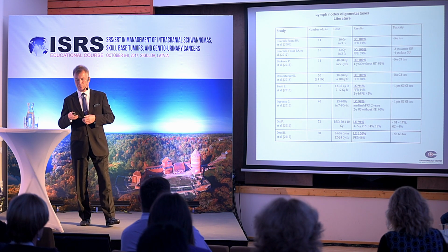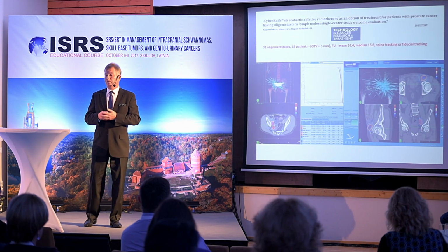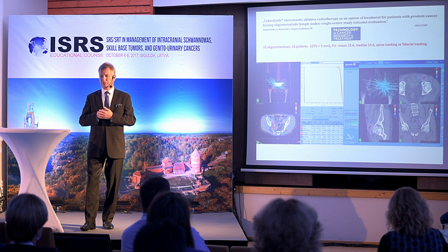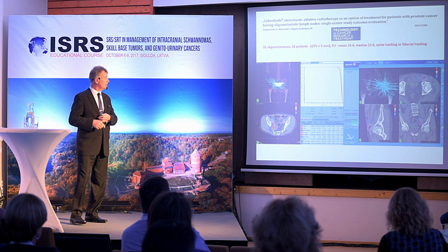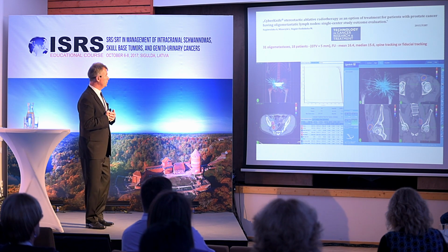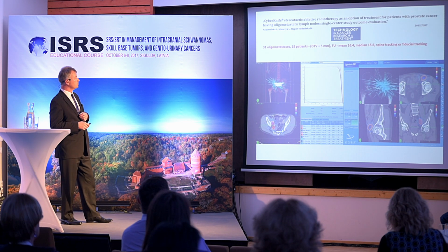So what was going on with this treatment? I don't want to give a lecture on the state of the art. I would like to stand on my personal experiences in this field. So we did something in this field. I published with my co-workers in Technology in Cancer Research and Treatment 2 years ago a very short series of 31 mets in lymph nodes treated with CyberKnife. I will talk only about the CyberKnife treatment.